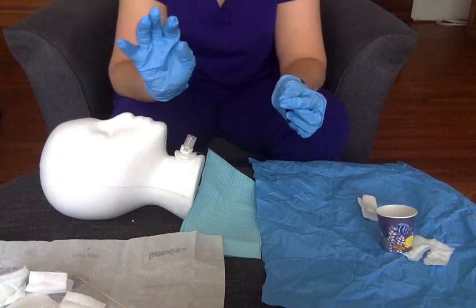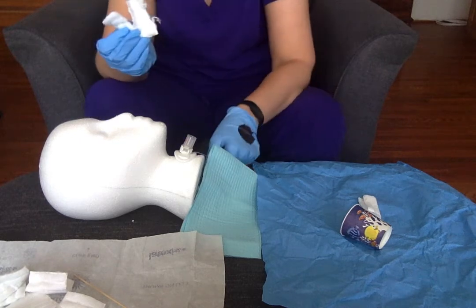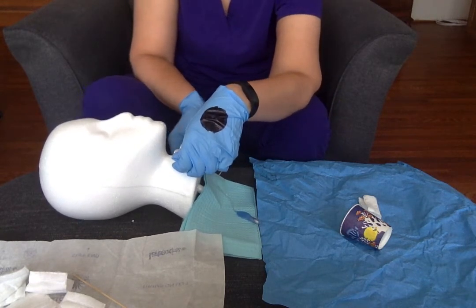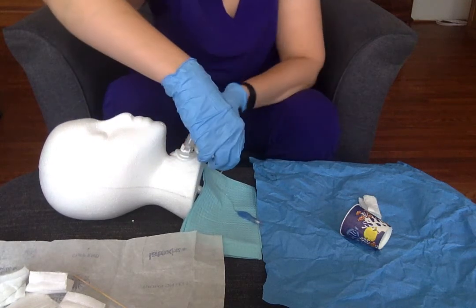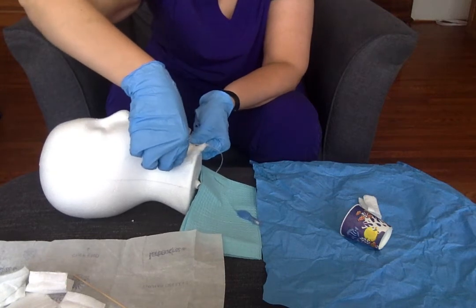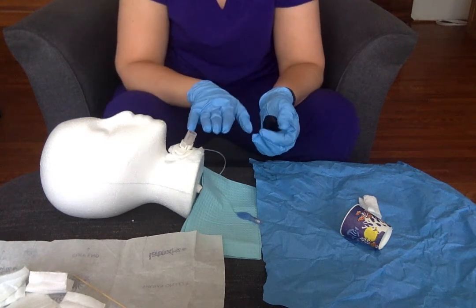At this point I'm ready to go ahead and put the dressing in. My sterile hand can pick up my fenestrated dressing, and this hand is going to assist me by stabilizing the face plate. I'm going to stabilize and slide this under. My new dressing is in. At this point I'm done with my sterile procedure — I'm not touching the site anymore.